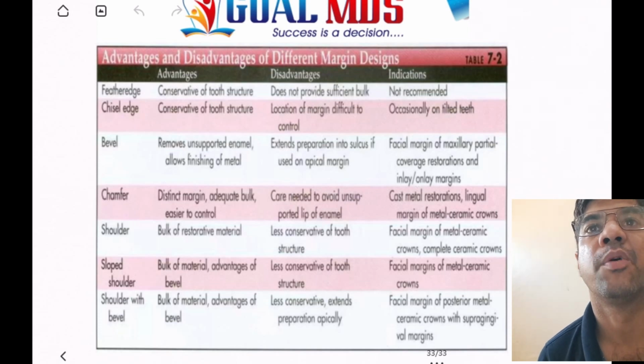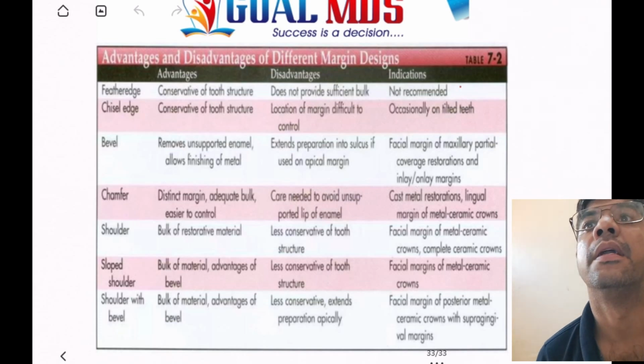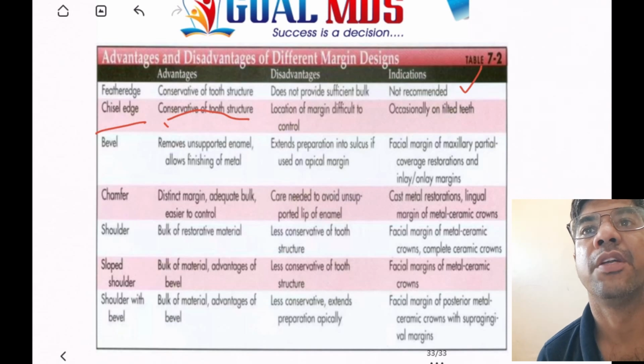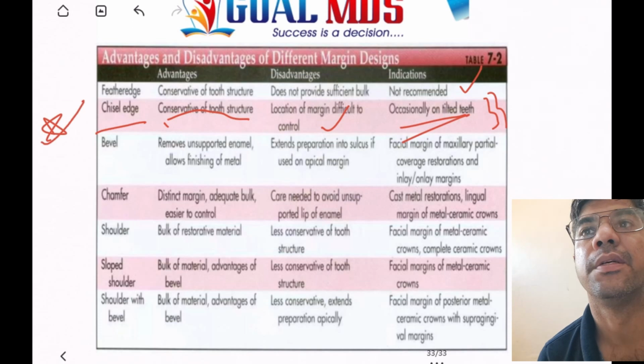The feather edge provides conservation of tooth structure, but it does not provide sufficient bulk, and it is not recommended. The chisel edge, there is conservation of tooth structure. Location of margin is difficult to control. It is generally done on the tilted tooth. So on a tilted tooth, which margin is given? It is the chisel edge.